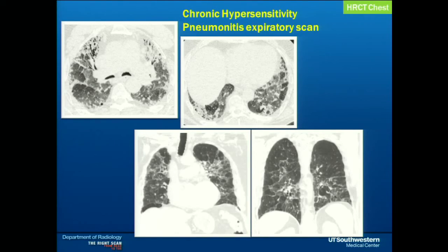So this particular scan helped in making the diagnosis without the use of biopsy. But unfortunately, the patient did not want to get rid of the parakeet. I think some people value their pets more than their lives.